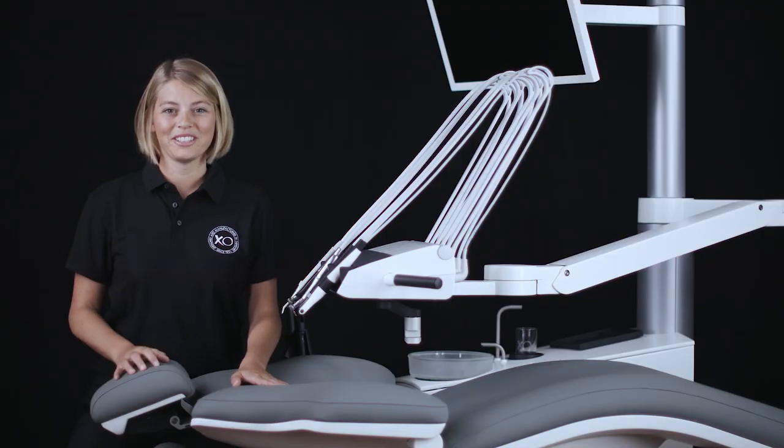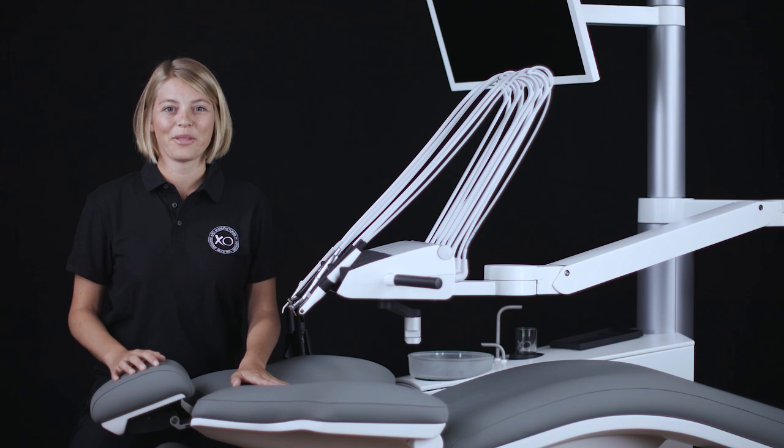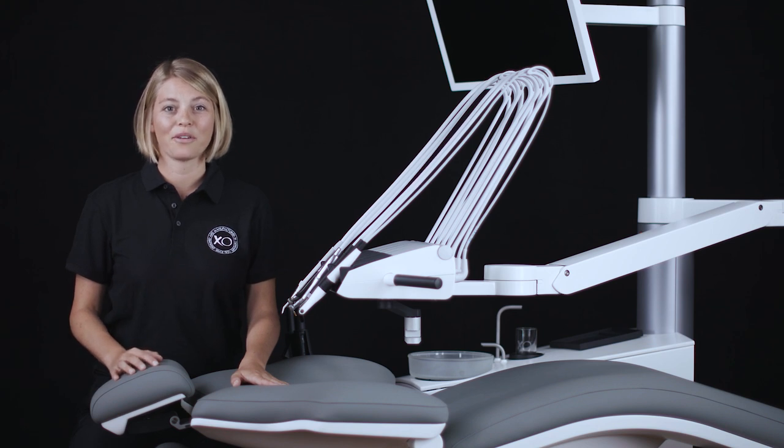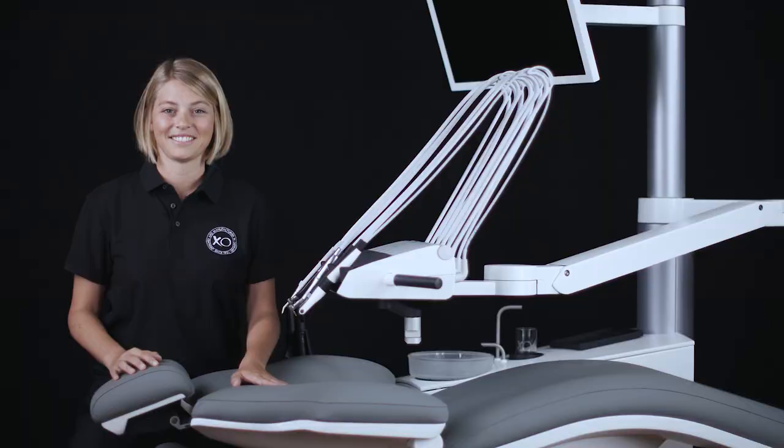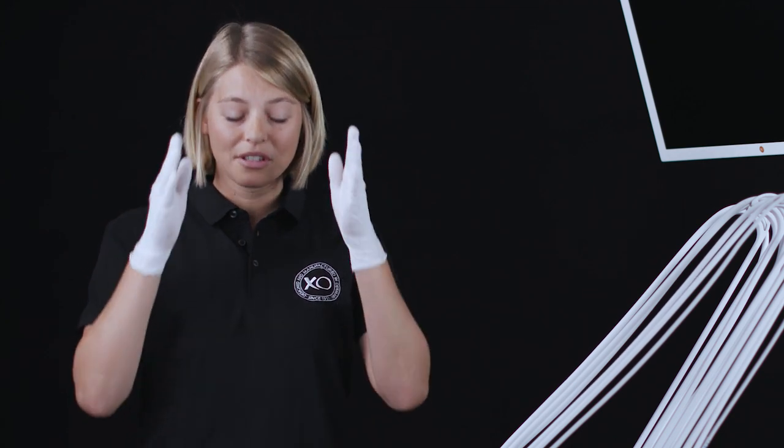In this video tutorial, you will learn about the function and correct operation of the foot control and joystick of your XO unit. You can control your XO unit hands-free with the use of the foot control and chair-based joystick. This will help you stay focused on the oral cavity.